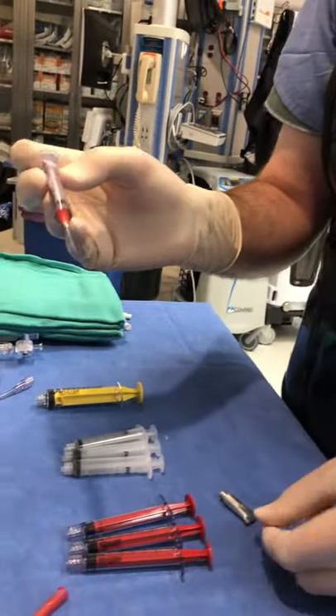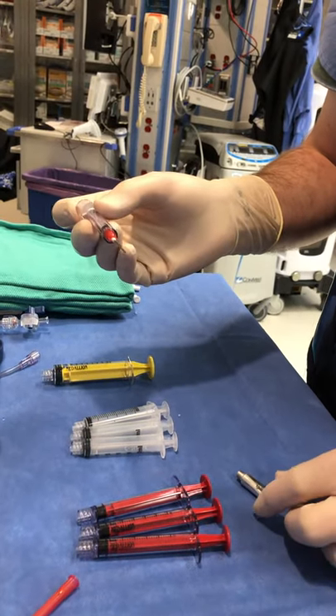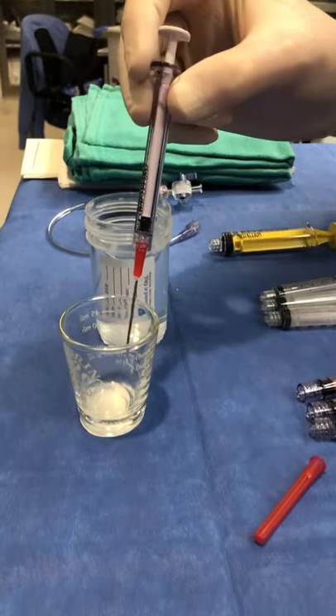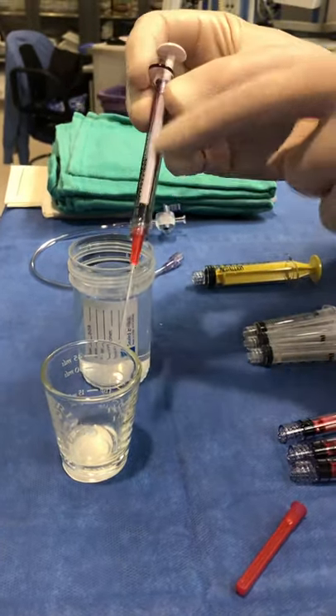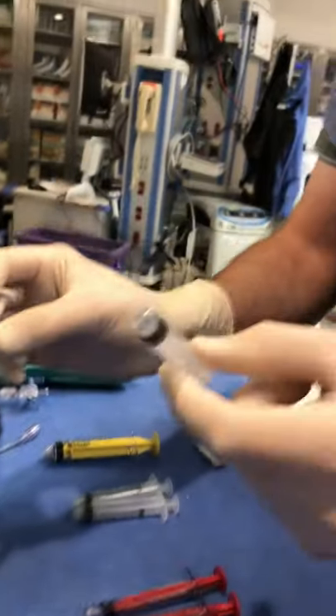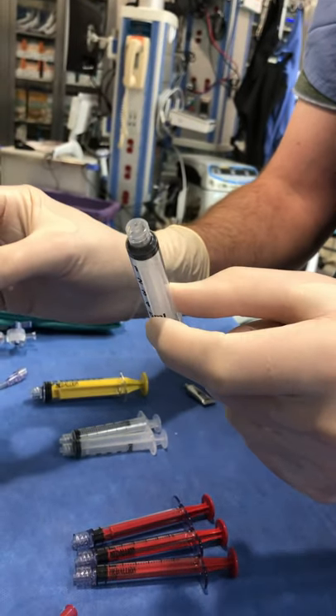Why a glass container? Because the oil and the glue tends to eat plastic — that's the reason why we use the hard plastic polycarbonate syringes. If you use regular plastic, it turns brittle almost immediately and will break before you even have a chance to inject it.